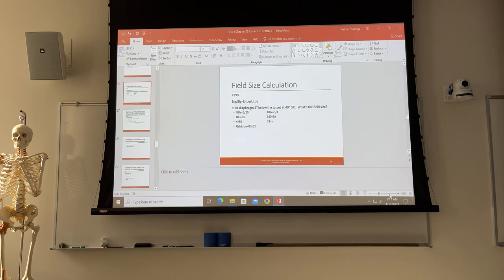You see that in that example 22.11, assuming that our diaphragm in 22.10 was what they used for this calculation, is rectangular, right? So the examples that you might see and the test questions you might have would sometimes have a rectangular type diaphragm that you would have to calculate your projected field size off of, which means you would have to work the problem twice, right? Once for length and once for width. If it's square, you would only have to work it once, but if it's rectangular, then you'd have to work it twice. So in that diagram, what it's showing is a single calculation.